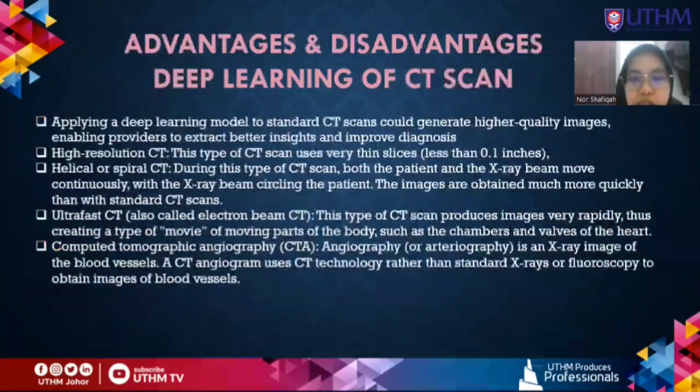So next are the advantages and disadvantages of deep learning for CT scan. By applying a deep learning model to a standard CT scan, it could generate a higher quality image, enabling us to extract better insight and improve diagnosis. So first is high resolution CT.